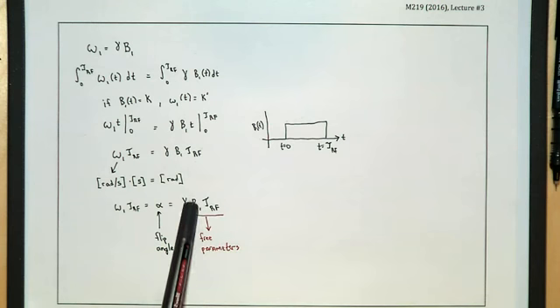So these things are pretty quickly limited to a relatively narrow range of possible parameters, giving us flip angles that are useful to do MR imaging. Anywhere from a couple of degrees to 180 degrees would be common. We infrequently need to do anything to our spin system beyond the 180 degree pulse, but you could have a 1000 degree pulse. It would just mean that your bulk magnetization was going past 180 through to 360, down to 540, back up to 720, and you could keep doing that. There's nothing that stops you except for physiologic limitations of SAR and heating and things like that. But physically, you could keep it going that way. Okay, so I think that's it for that.